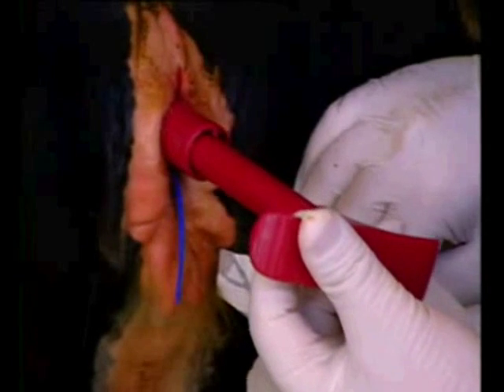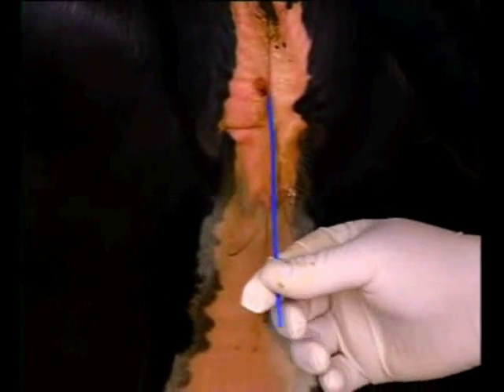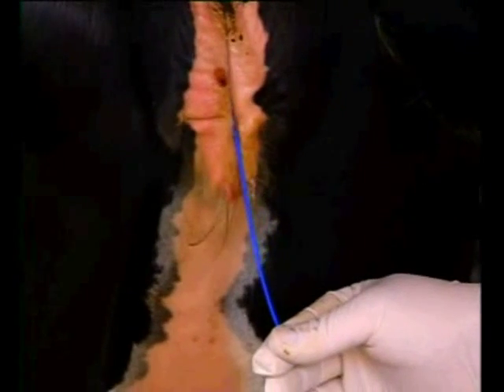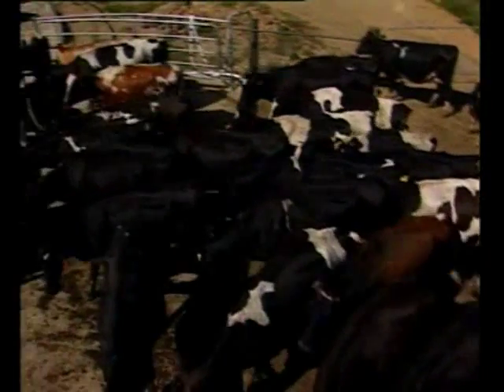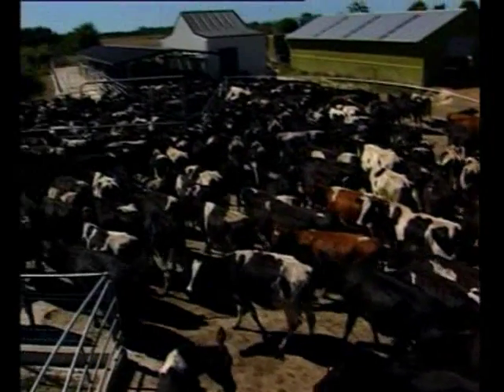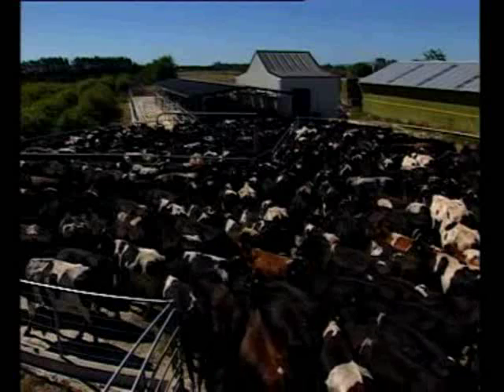Withdraw the applicator and check the tail is protruding as shown. In heifers or smaller cows, the length of the protruding tail may be longer. If the tip of the wishbone is visible after insertion, the device has not been correctly inserted — remove and reinsert the Q-mate. Heat detection systems such as tail paint and the use of other hormone treatments like prostaglandin and estrogen are used in conjunction with Q-mate.